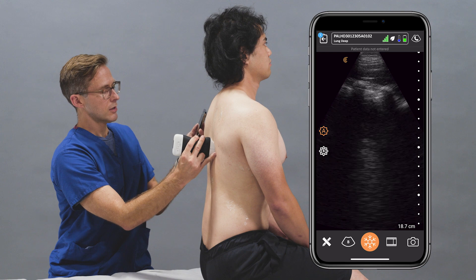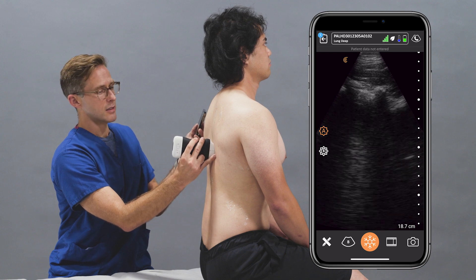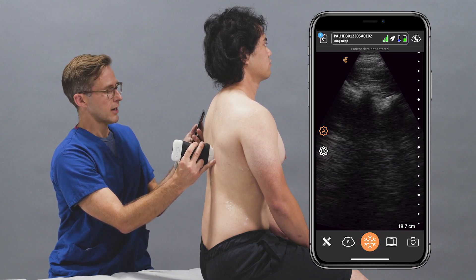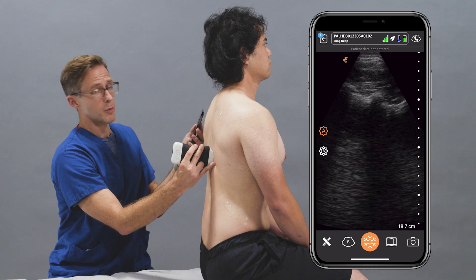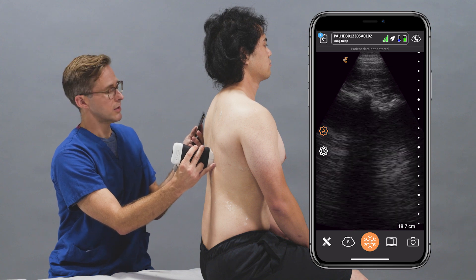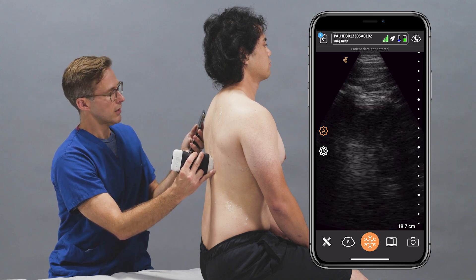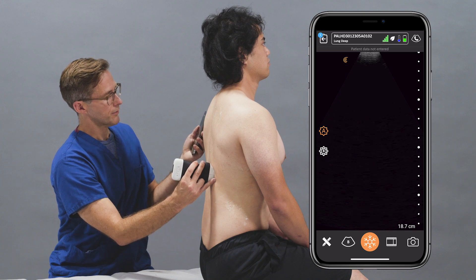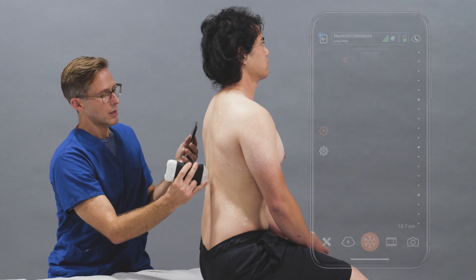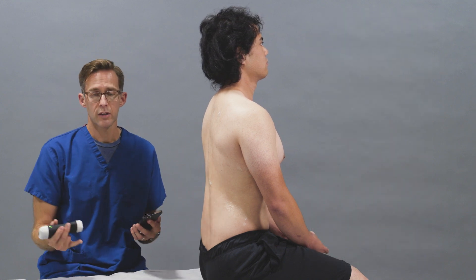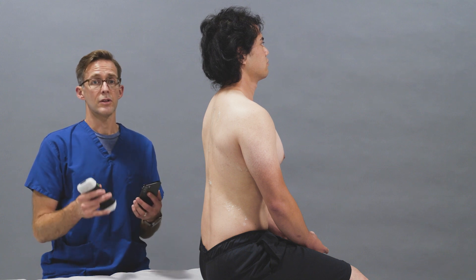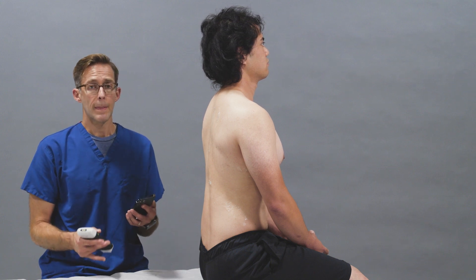If you're doing a thoracentesis, this is actually where you'd typically do it, and this probe is excellent for identifying the ideal placement for thoracentesis. We scan all the way to the base of the lungs. So with ultrasound at the bedside, you can identify pneumothorax, pleural effusions, consolidation, and pulmonary edema. Thank you.